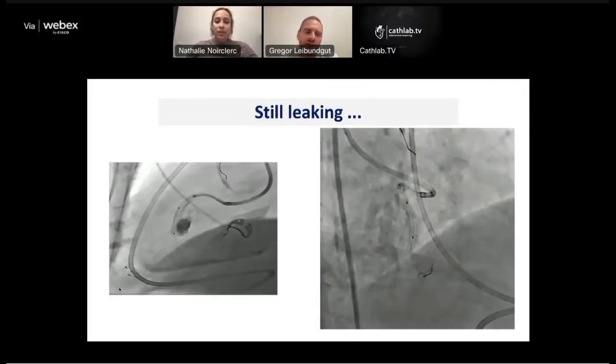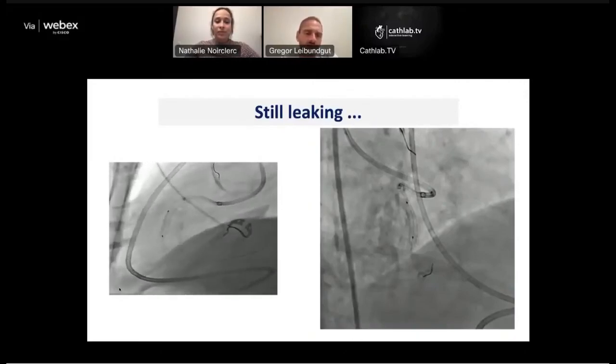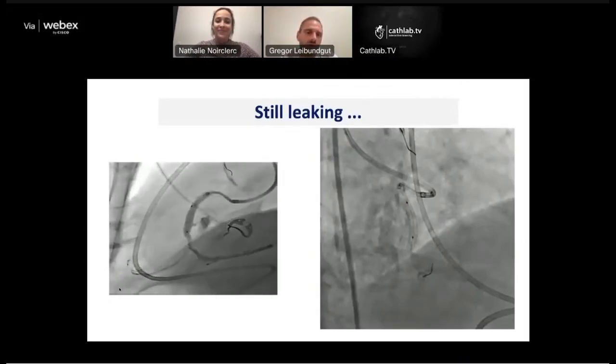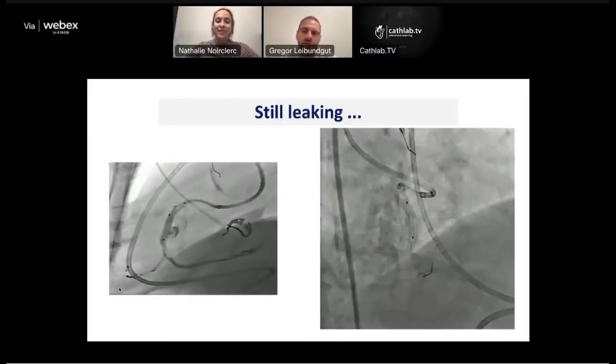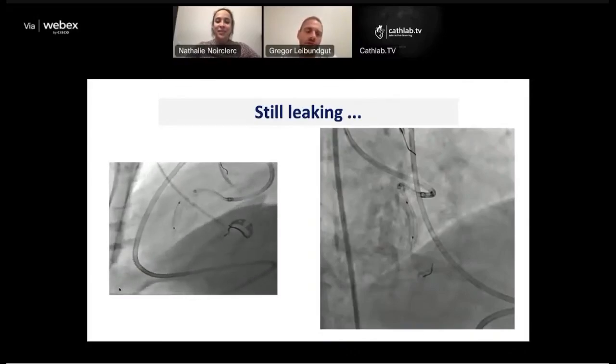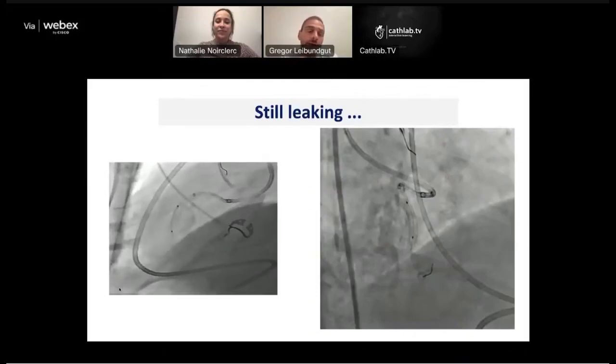This is the typical finding. I think in 80 to 90% of the grafts that I had to place due to a perforation, this is the result you get. So I learned two things from it. First of all, don't try to take the shortest graft, take a little bit longer than you would stent the lesion. Because at this point, it's not about short stents, it's about saving the patient's life. And if you take a little bit longer graft than you would stent, you're more likely covering the lesion, the perforation.